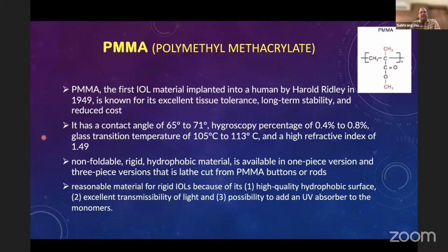It is, as we have discussed, non-foldable, rigid, hydrophobic, and is available in one-piece version as well as three-piece version, that is lathe cut from PMMA buttons or rods. It's a reasonable material for rigid IOLs because of its high quality hydrophobic surface, excellent transmissibility of light, and the possibility to add a UV absorber to the monomers.